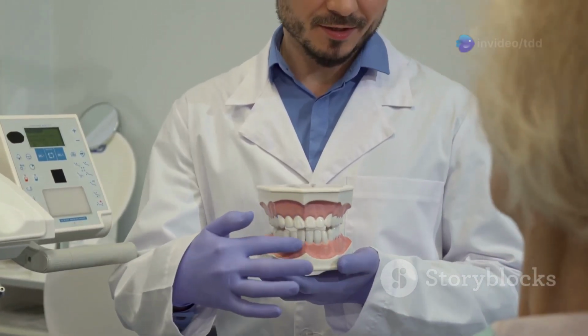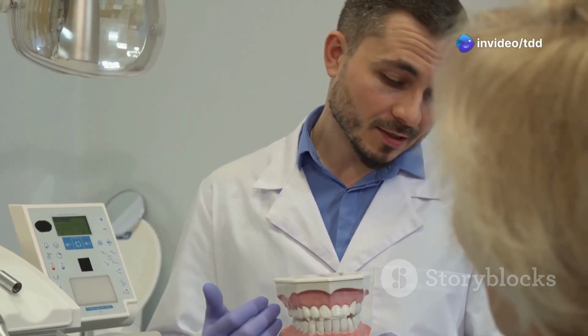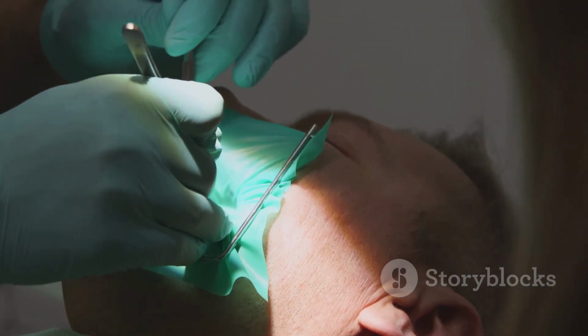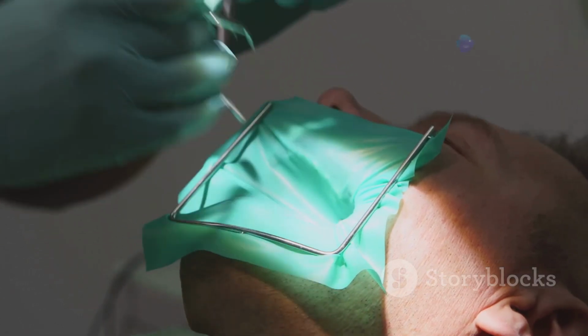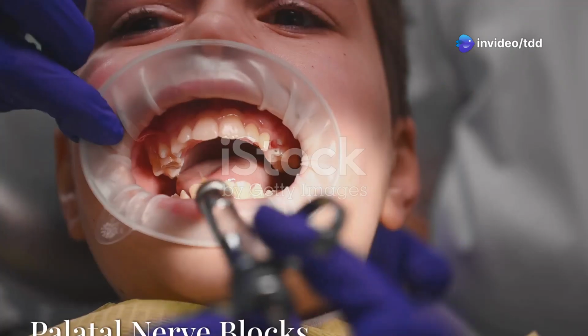The purpose of the anterior superior alveolar, or ASA nerve block, is to anesthetize the maxillary incisors, canines, and their soft tissues. You should inject over the apex of the canine or via the infraorbital foramen. The landmark to look for is the height of the mucobuccal fold near the first premolar.